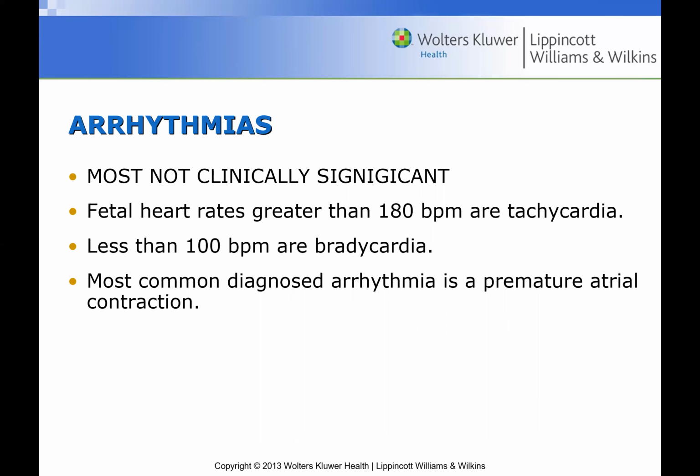So here is our, again, greater than 180 is tachycardia, less than 100 is bradycardia. 100 to 120 though, I definitely would mention on your report. I would not let a patient leave in the 2nd, 3rd trimester if the baby's heart rate was 101. I would definitely be calling the doctor because that's just too low, I feel like.